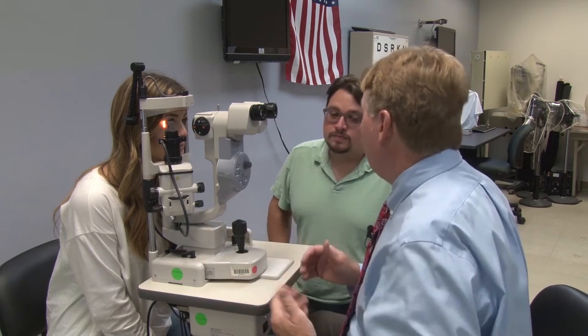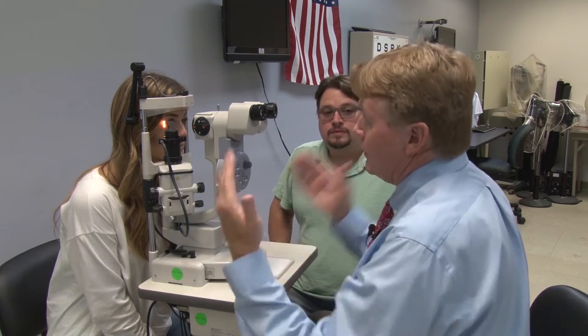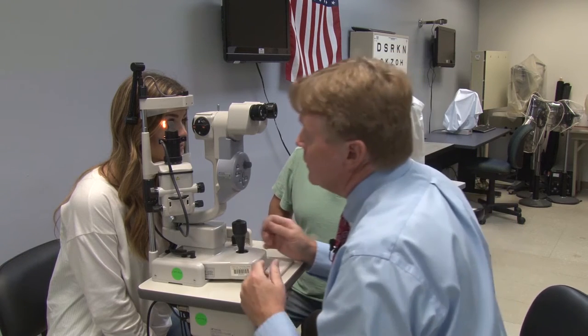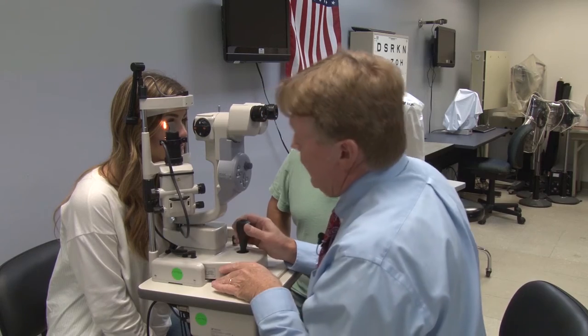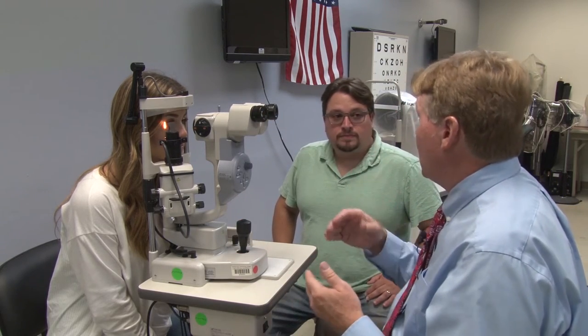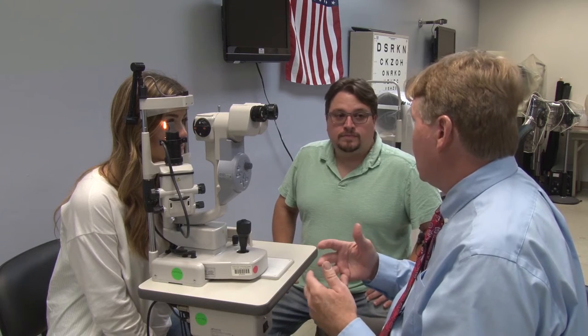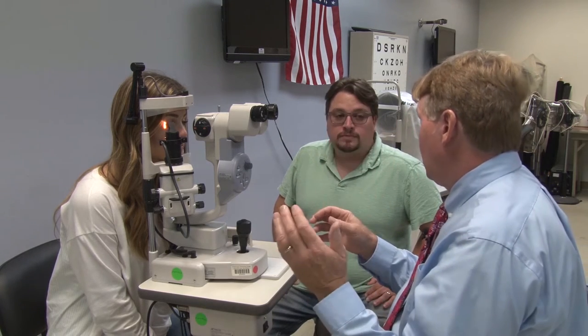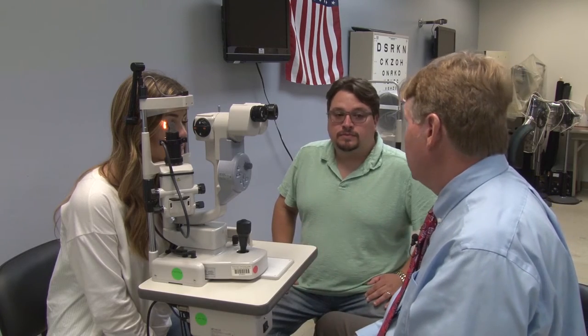We're going to be using direct focal illumination, meaning that the microscope and the light source are looking directly at what we're trying to observe. We're going to go through a sequence where we do the lower lid margin, upper lid margin, lower palpebral and bulbar conjunctiva, the nasal bulbar, the upper bulbar, the temporal bulbar, and then we'll move on to the cornea.